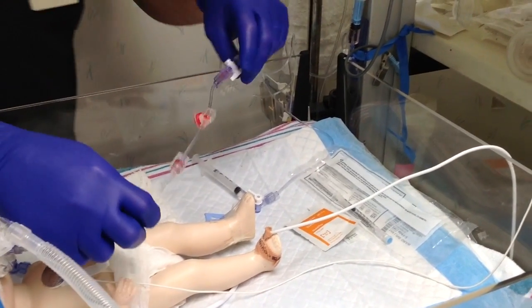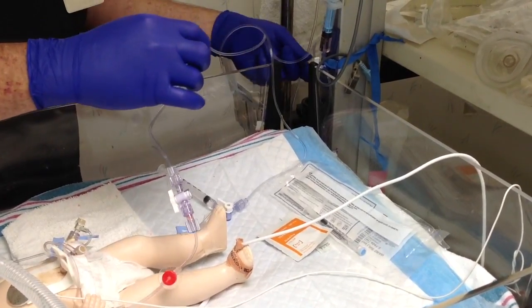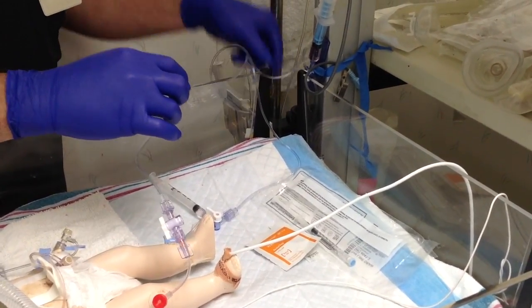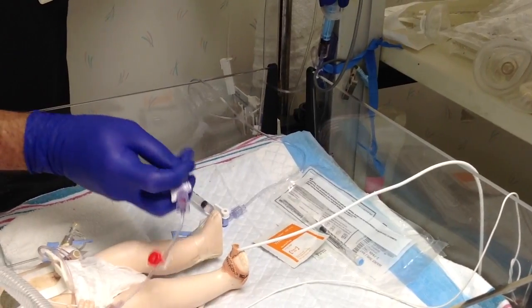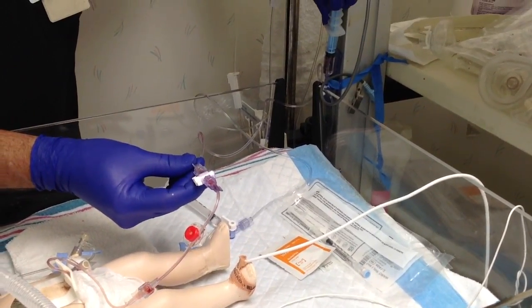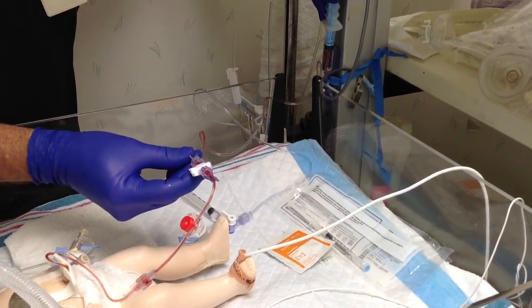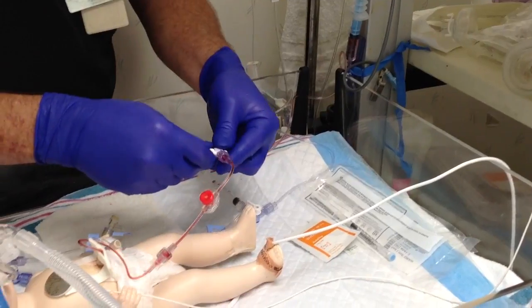Follow your UAC line back to the flush syringe. You want to open the stopcock on the flush syringe so it's open to the UAC side. You want to begin pulling slowly, blood back, past the draw site, past the first stopcock about 2 inches. Close the stopcock off.